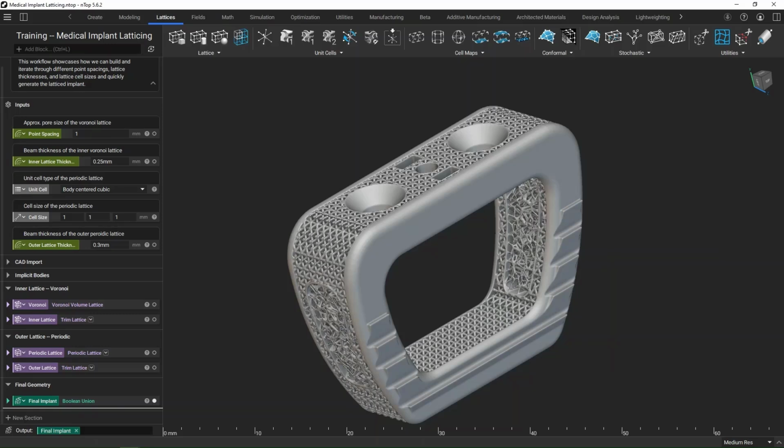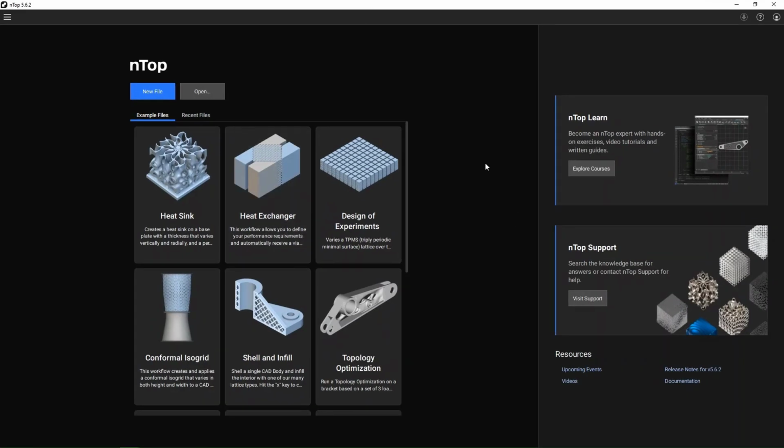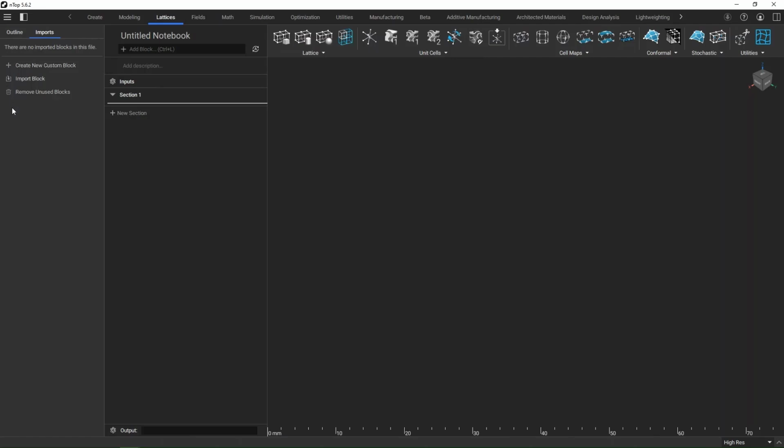And then what we're going to do is actually open up a brand new instance of nTop. So here we have our new instance of nTop. I'm going to hit New File. And there are a few different ways that we can bring that custom block into this new instance of nTop. So I can go ahead, File, Import. I can also check out my imports over here in this left side panel, and I can import a block.